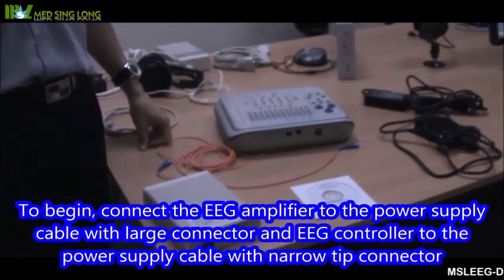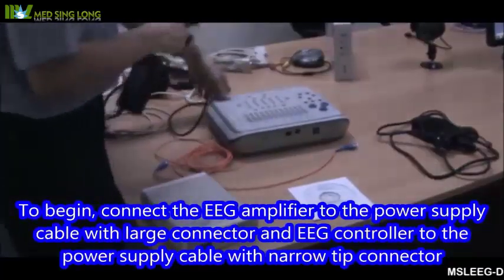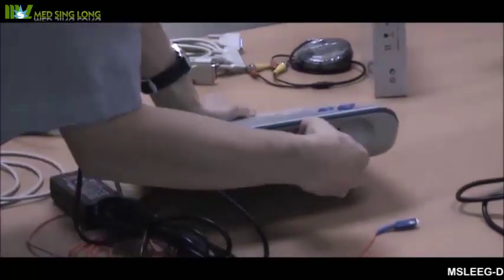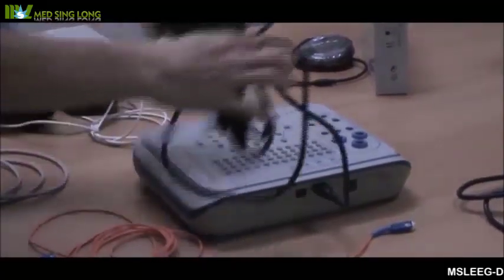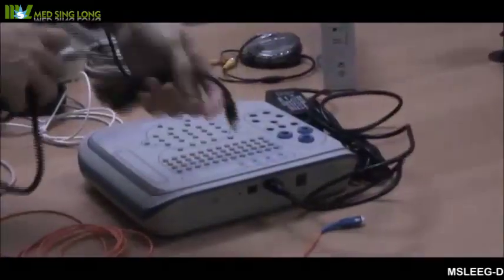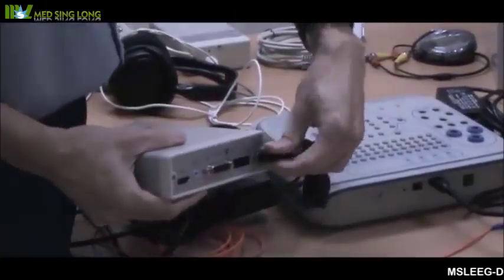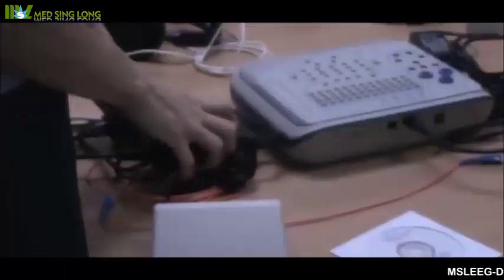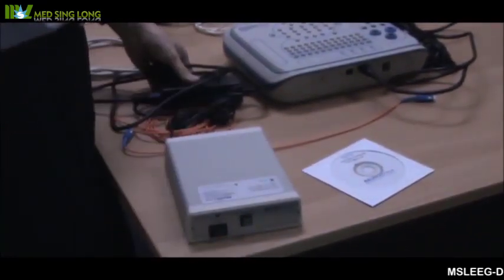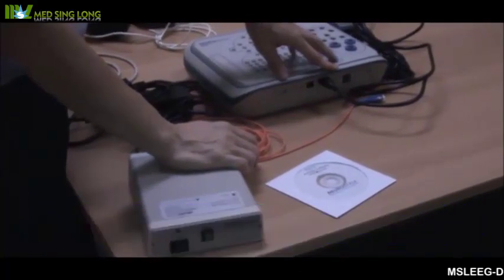To begin, connect the EEG amplifier to the power supply cable with large connector and EEG controller to the power supply cable with narrow tip connector. Note that the power connector of EEG amplifier is at the front of device, and its power supply should only be for recharging purpose.